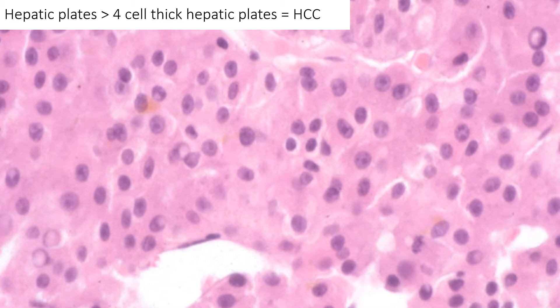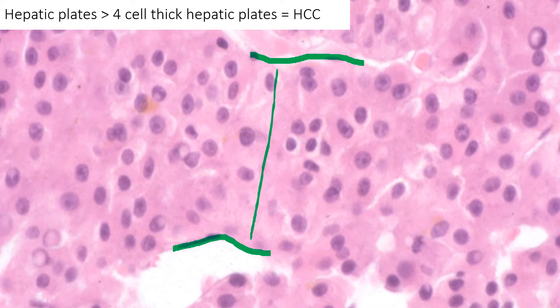The question is, how do you measure the thickness of a plate? You do it by endothelial wrapping. There's endothelial wrapping there — that's the endothelial cell, and that defines the thickness of your plate. Counting: one, two, three, four, five. This is hepatocellular carcinoma. Easy.